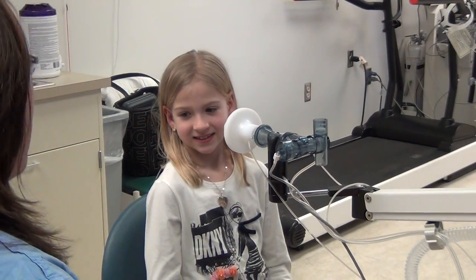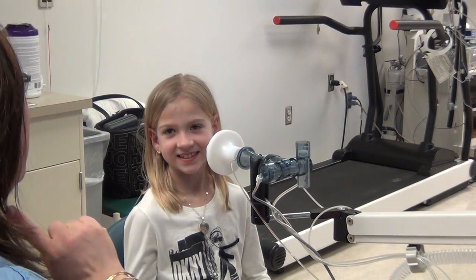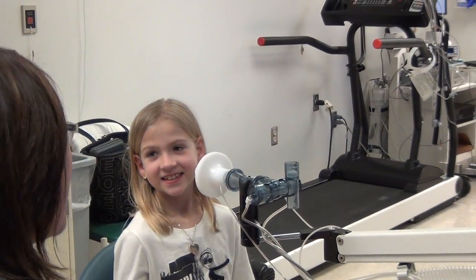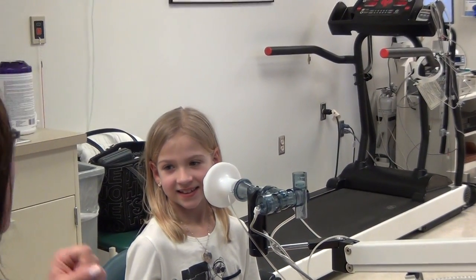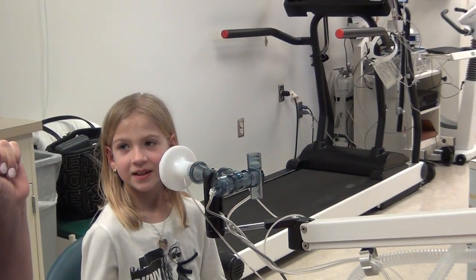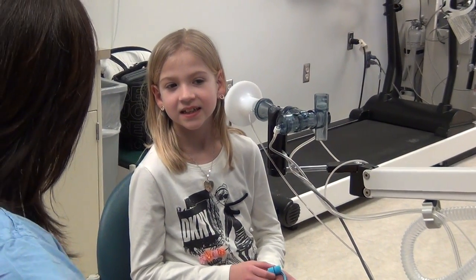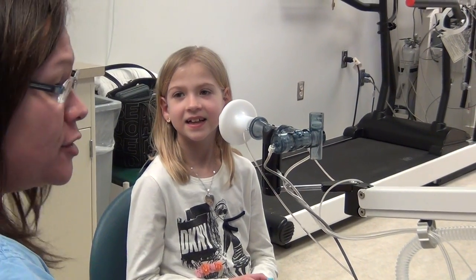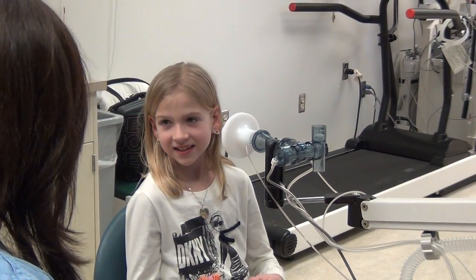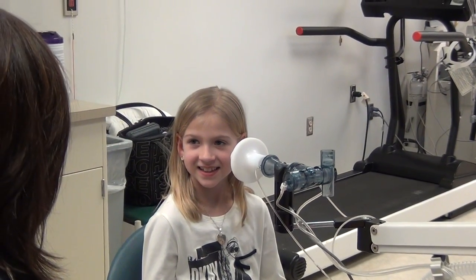Really hard and fast out. Did you notice how I did that? You can do it. You're going to keep blowing though — you're not going to breathe in. You're going to keep blowing till I see a green bar that flashes across here. You can watch too, and if you see that before me, go ahead and take a big fast breath back in and then you can come off.